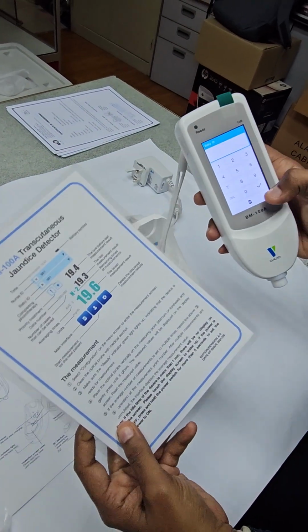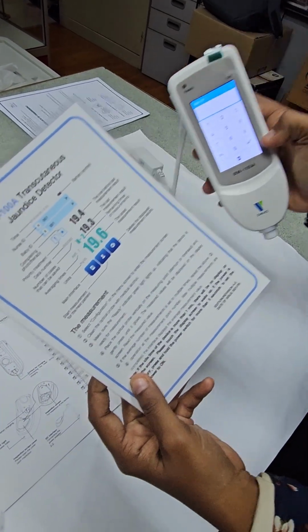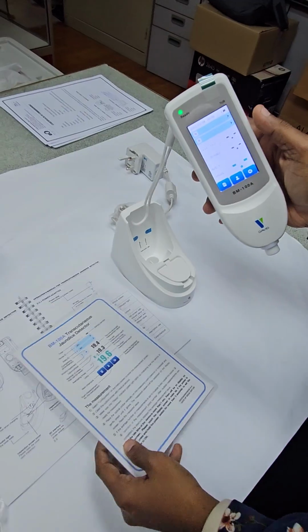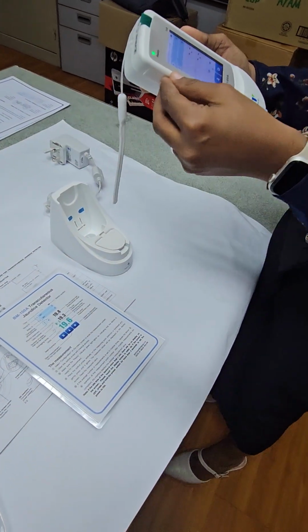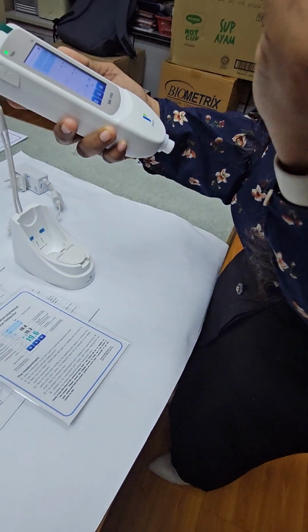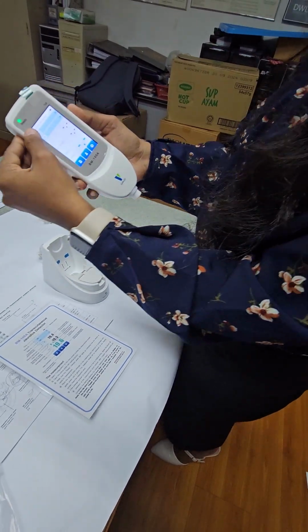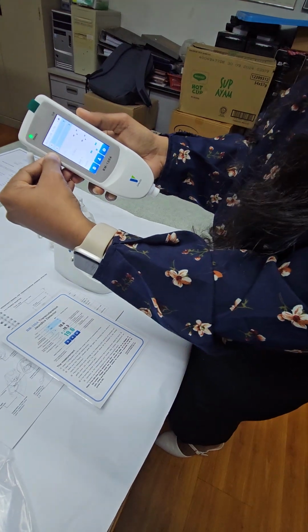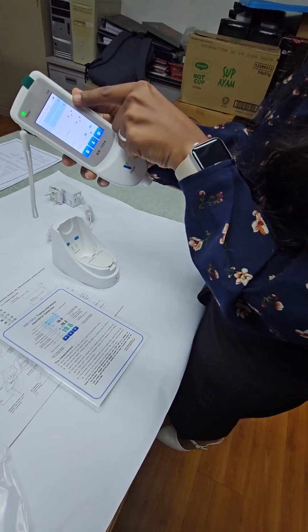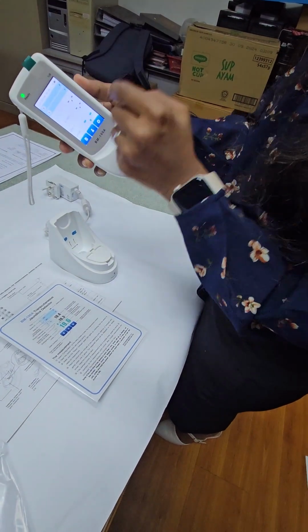Measure. Baby ID is not compulsory, so we can just click this. I think they have many babies, so normally they have the RN number. In a hospital, it depends; they will use the baby's ID 1, 2, 3, or their code number. The N is for nurse ID and B is for baby's ID. If there's an ID, it will display here.